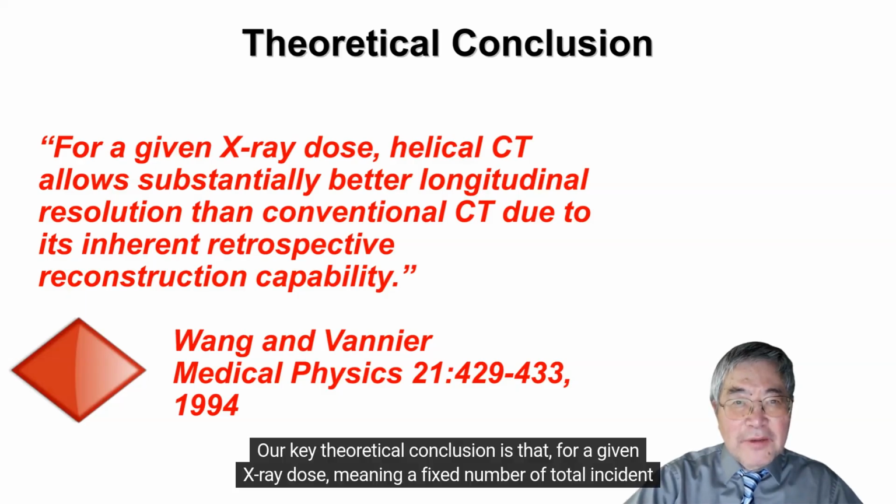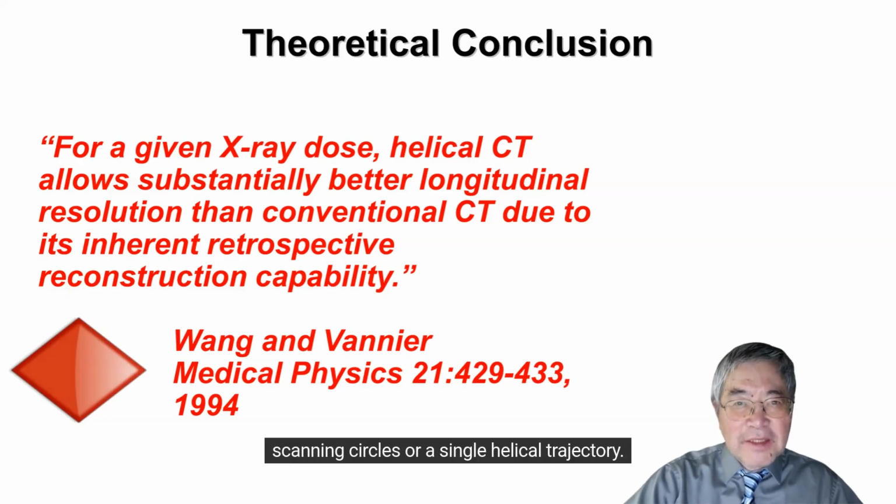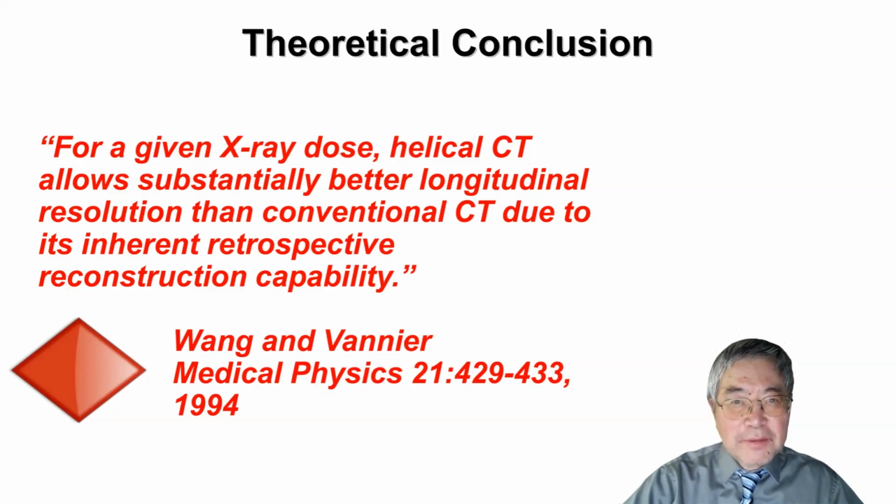Our key theoretical conclusion is that for a given X-ray dose, meaning a fixed number of total incident photons, you can choose to scan in either the conventional step-and-shoot mode, with multiple scanning circles, or helical mode, with a single helical trajectory. Given the same X-ray dose, helical CT offers substantially better longitudinal resolution than conventional step-and-shoot.